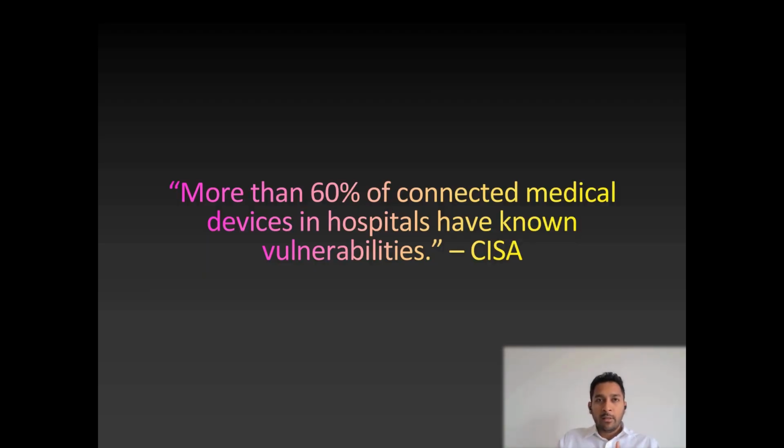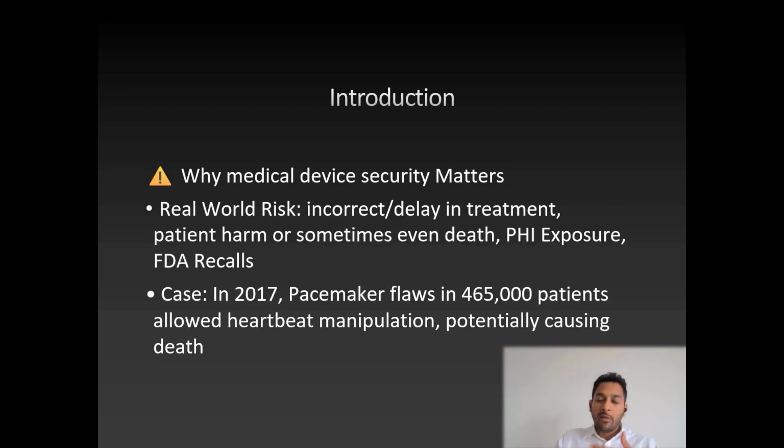All right, there's a fact for you. More than 60% of connected medical devices in hospitals have known vulnerabilities, according to CISA. It's not a small number. It means the majority of the devices in the hospitals have vulnerabilities. Having said that, why does medical device security matter?